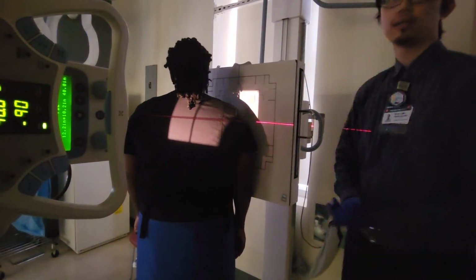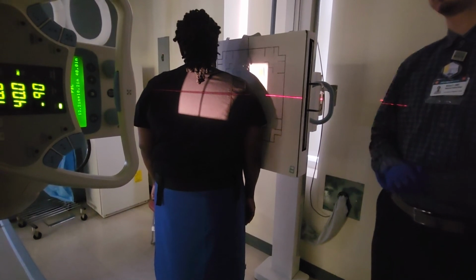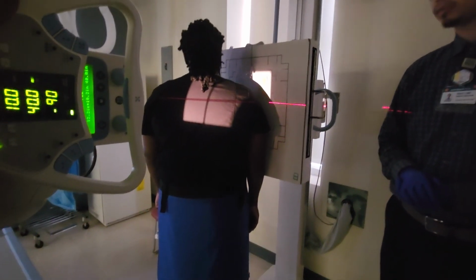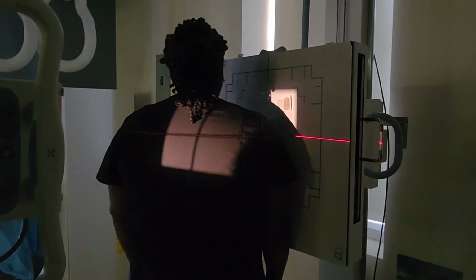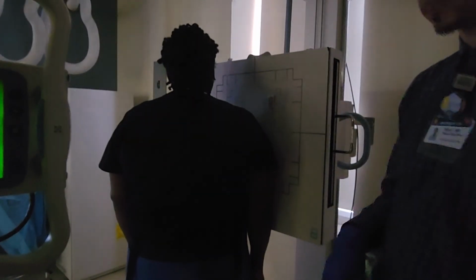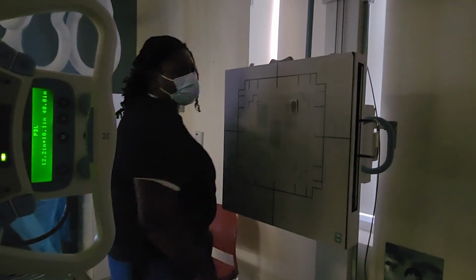PA. And then, okay, Shamika, hold your breath. X-ray, you can breathe. Are we okay with this? Understand how we got this rotation? Just find scapula, find AC, line them up. So that's the superior angle of the scapula and the AC joint. Okay, great. You can relax, Shamika.